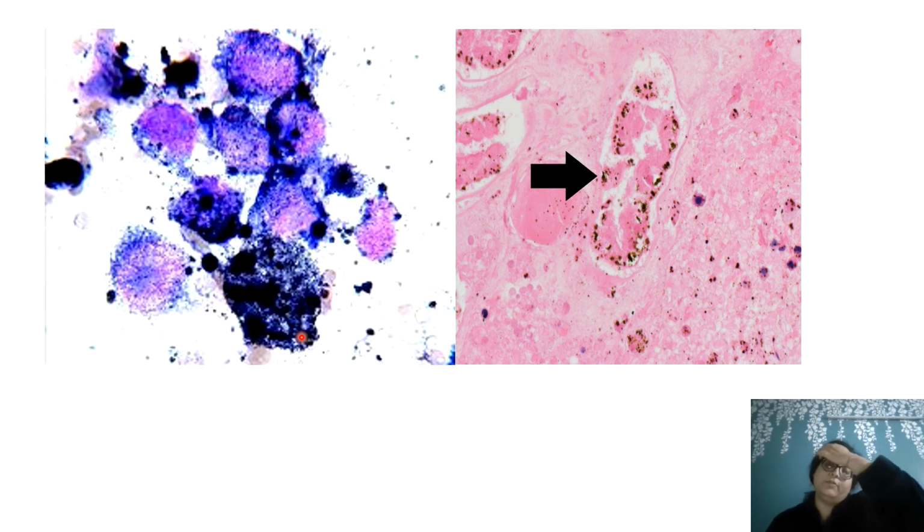In histopathology bone marrow biopsies, you might get something like this. The color will be of hemosiderin, but the texture will be very powdery, not like coarse granules. So this is formalin pigment. This is a deposition artifact, a tissue processing artifact. This is not a true pigment.